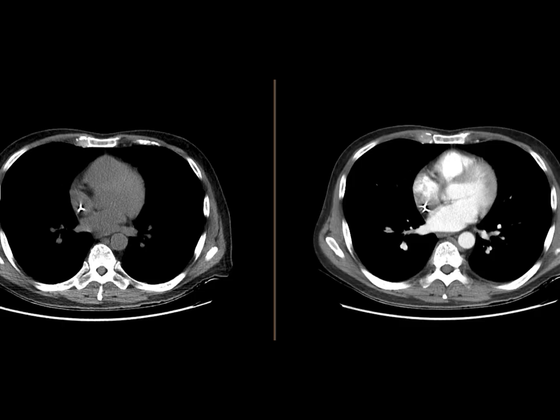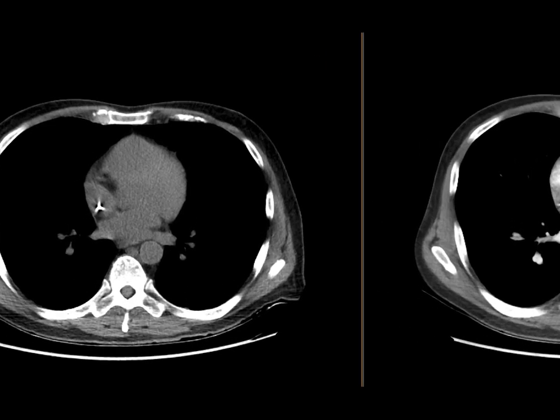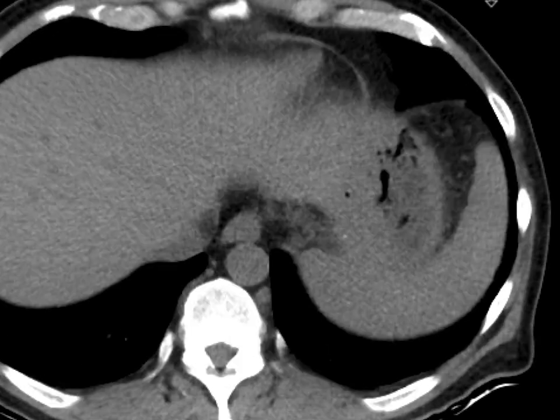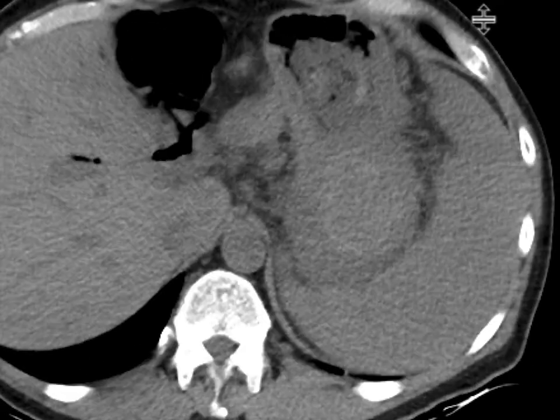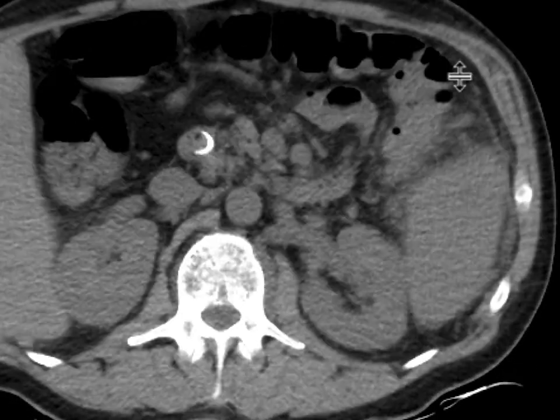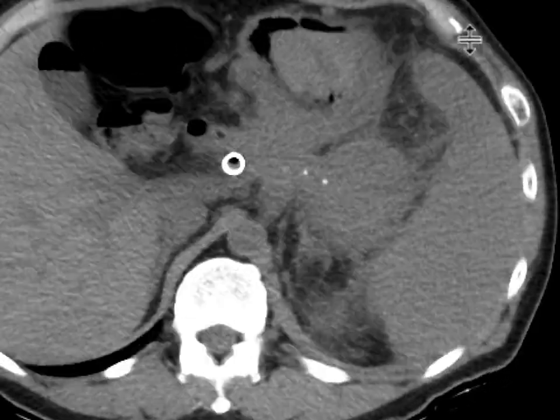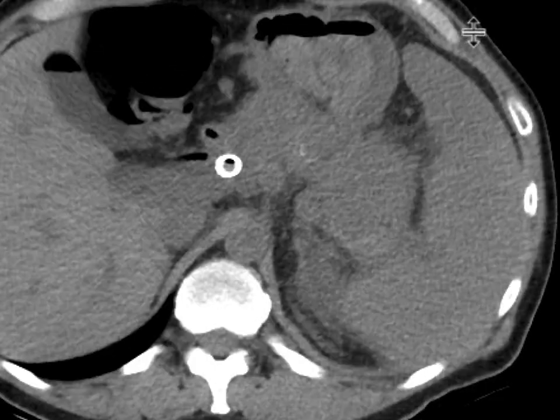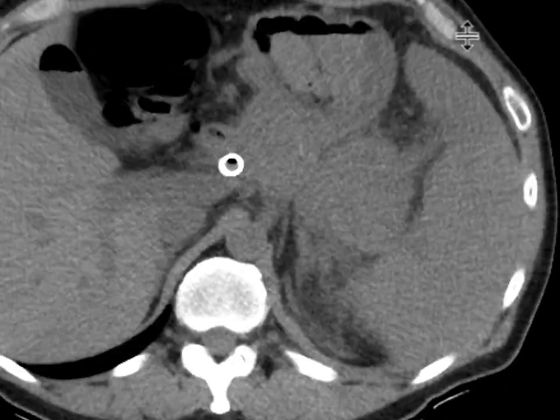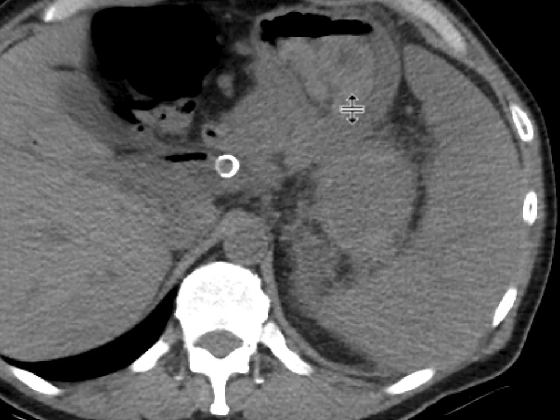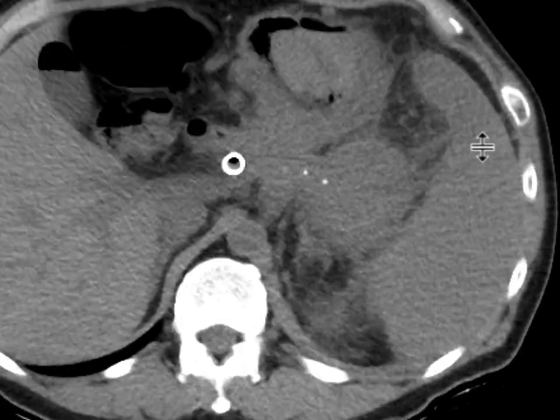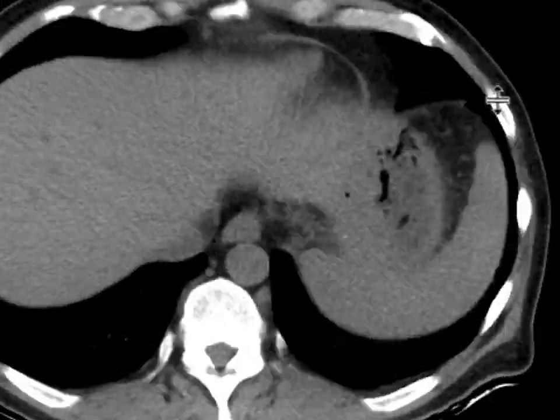This is a patient with pancreatic cancer that came in with melena, which was concerning for bleeding. Looking at the non-contrast CT that was initially performed, you can see there is lots of ill-defined tissue within the pancreatic tail — much of that represents the neoplasm. There is also high-density content in the stomach, which likely represents blood products, as well as a biliary stent with some pneumobilia in place.